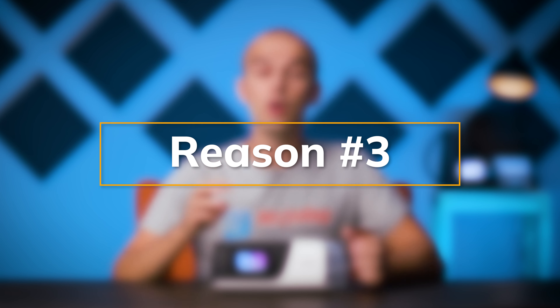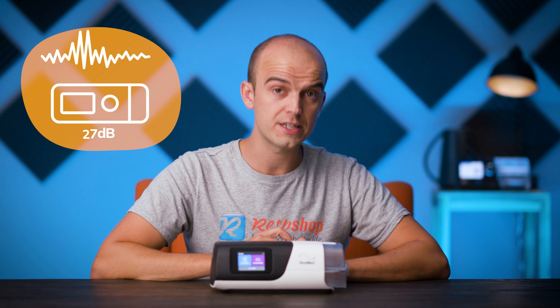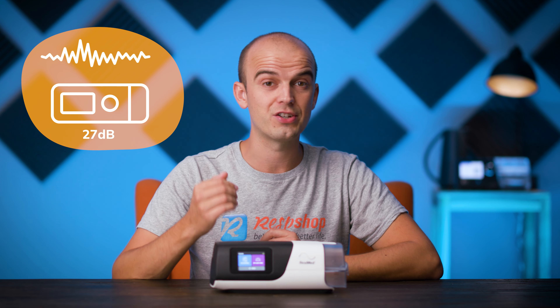Reason number three. Although the AirSense 11 and the AirSense 10 both have an official noise rating of 27 decibels, many users report that the 11 is louder at high pressures. So if you need high-pressure therapy and noise is a major concern, there might be quieter options out there.